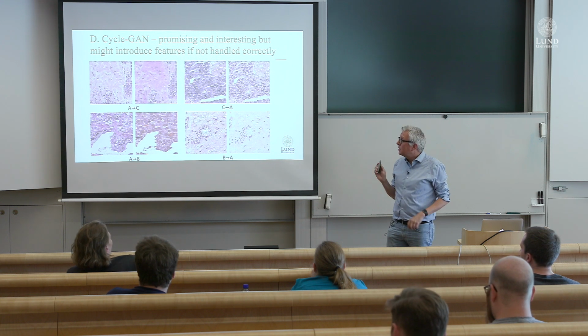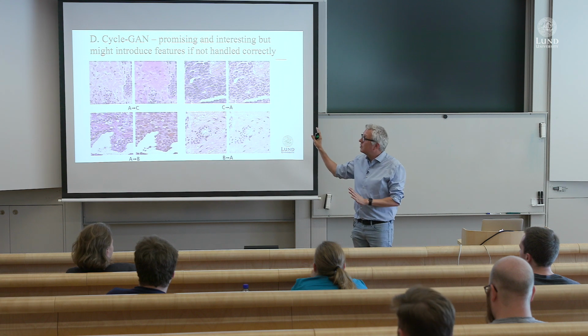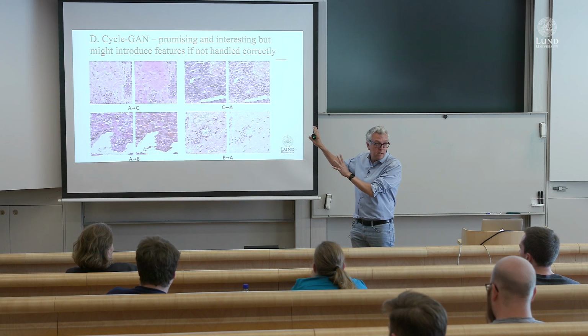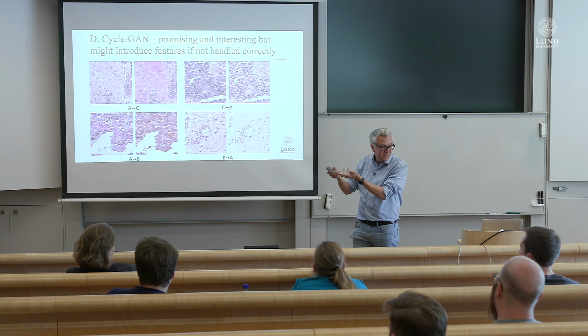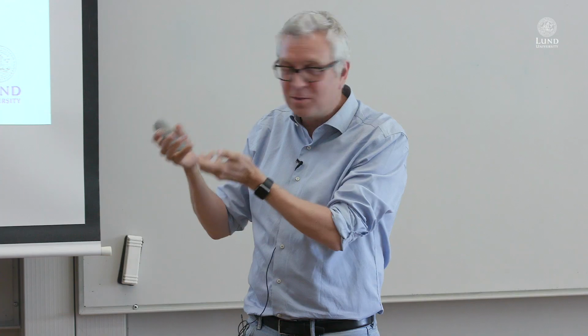it yet. And that's the fact that it doesn't only change the color and the shading, but it can actually also add cell nuclei and change the images. And that's not really what we want.